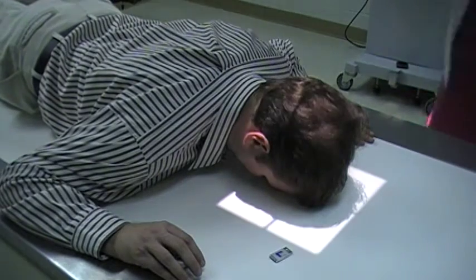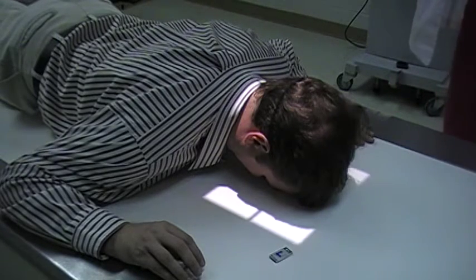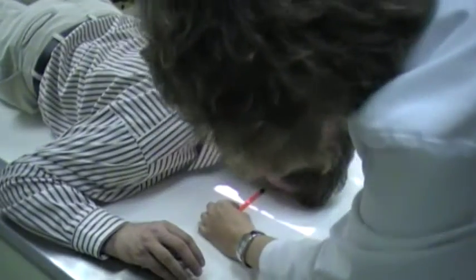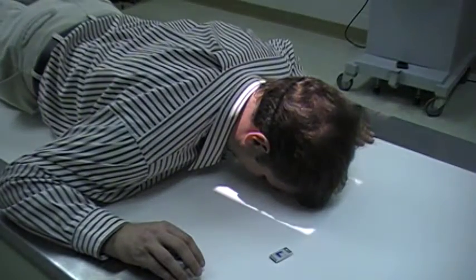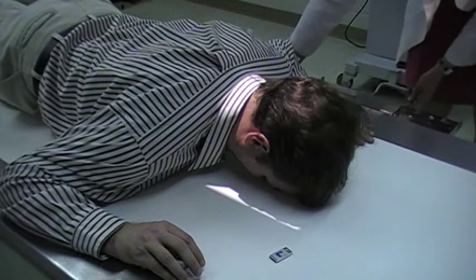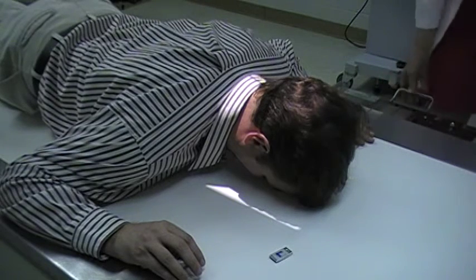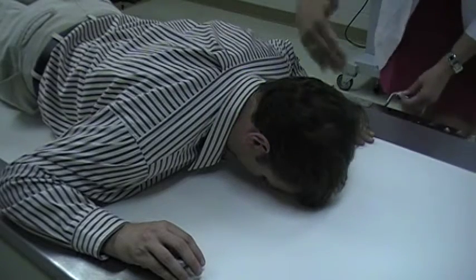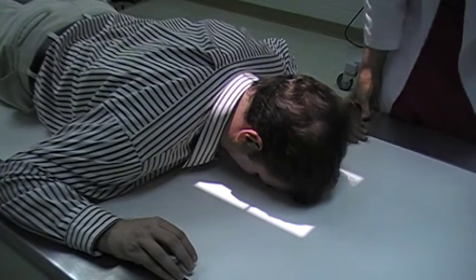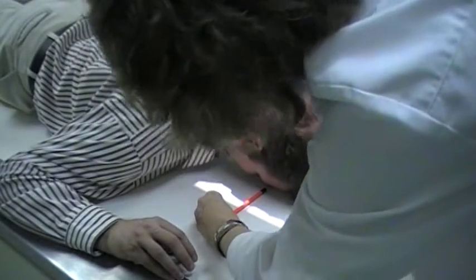Now, the central ray is going to exit out of the nasion, so you can do a visual check and make sure that this is the same level as the nasion right there, so I can move my central ray down just a little. And for this, you want to be sure that your image receptor is portrait. Okay, and this is the left side. Okay, that looks better.